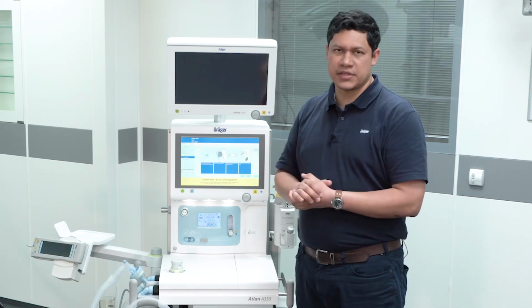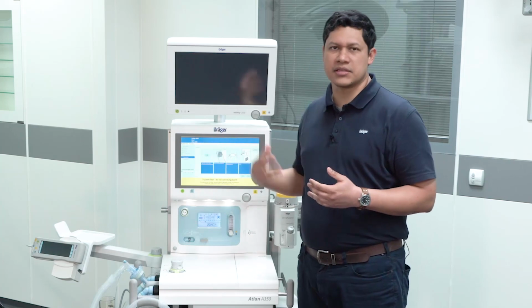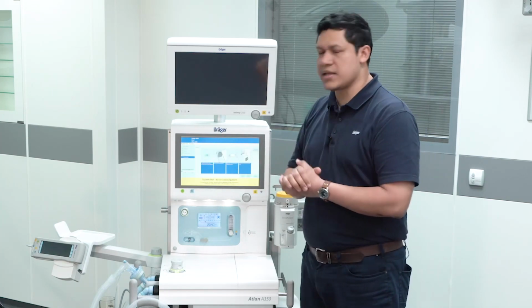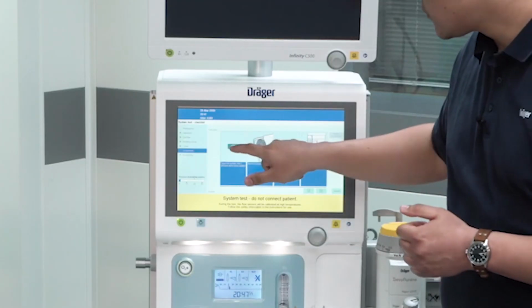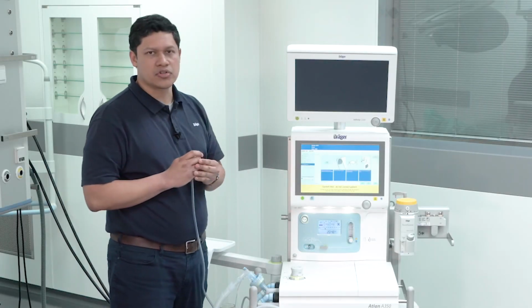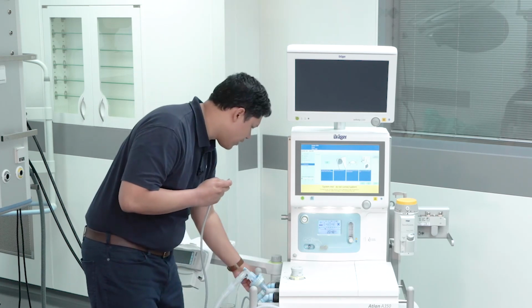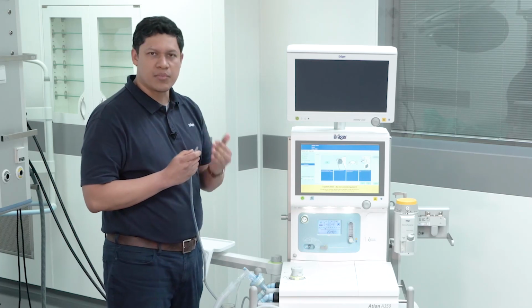The next group of test elements to verify are different components around the anesthesia device. The first one is to press this sign and to verify the audible tones. The next element to verify is the bronchial suctioning system. Then you will have to put it to the maximum level of aspiration, and you have to verify that flow and pressure are present.